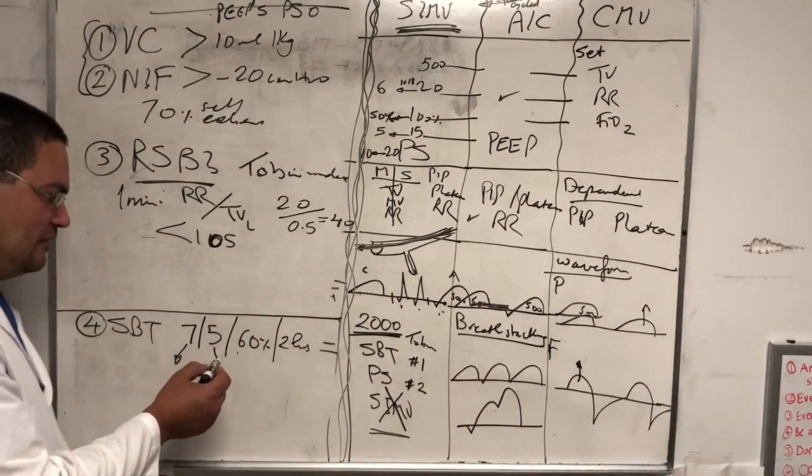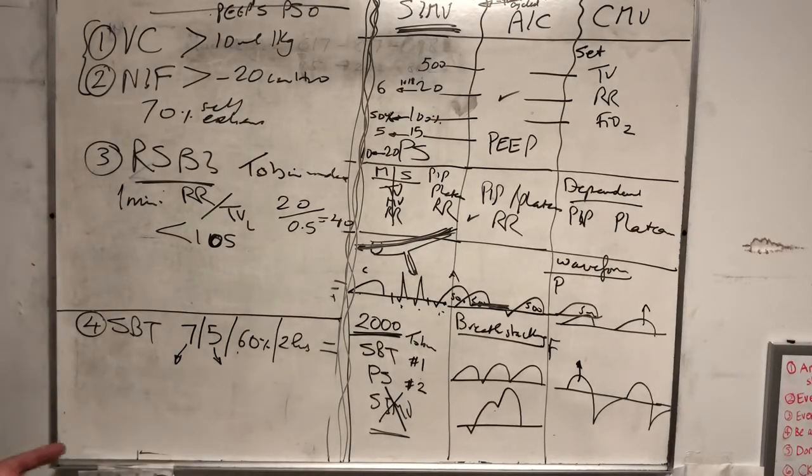All right, the 5 is the PEEP, obviously. Why 5 of PEEP? Because we know that the vocal cords close before the end of the breath completely, so it leaves a little bit of FRC. If you're bypassing the vocal cords with the tube, you have to give the patient that, otherwise he's going to exhale to full. Like everything is going to come out, right?